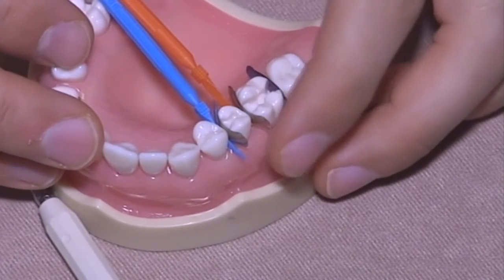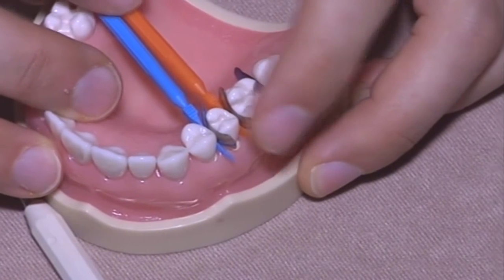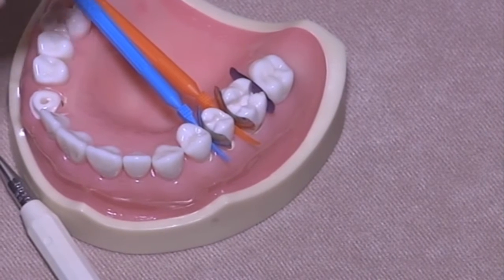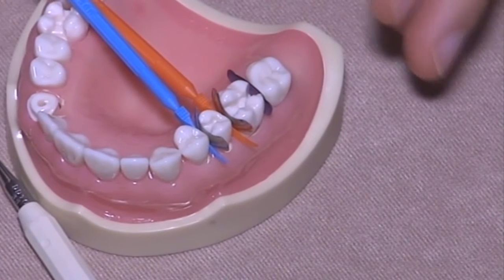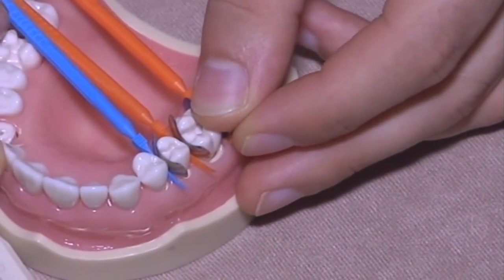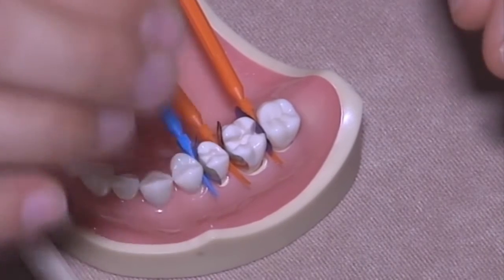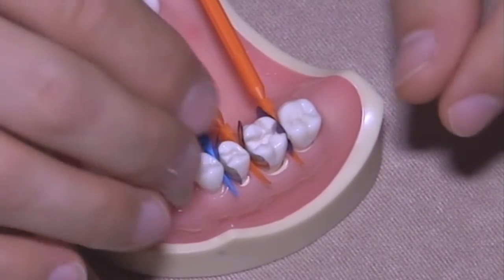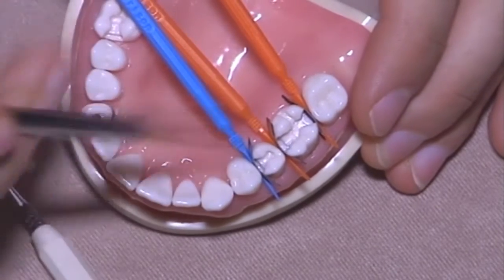I have no clear preference on plastic or wood wedges. Actually, I think that wood wedges are easiest to adapt because they are softer than plastic ones, but they both work in a good way. Remember that with the sectional matrix, the use of wedges is for adapting the matrix to the cervical area of the cavity.